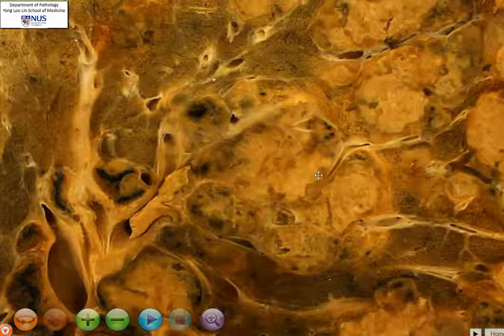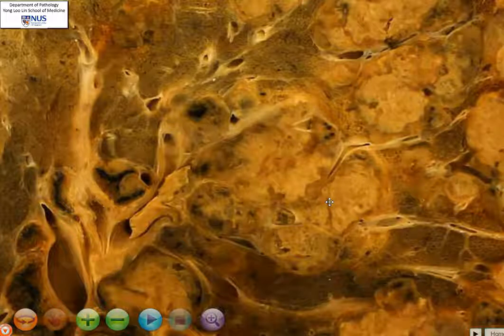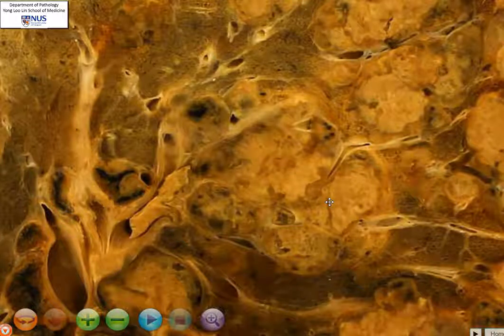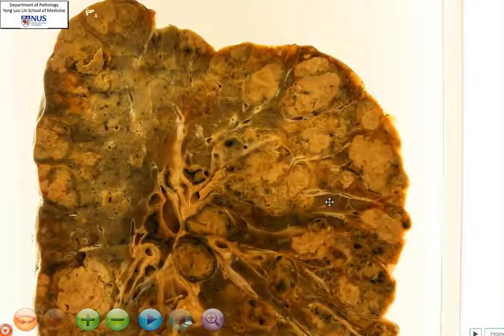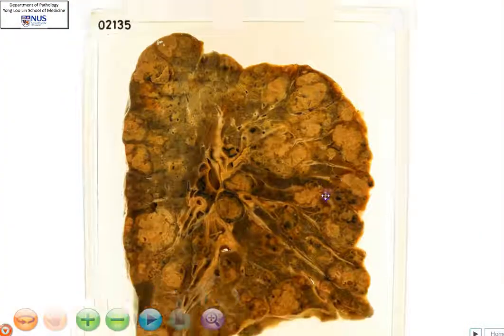These represent areas of necrosis. We learned that if a tumor is growing rapidly, it will usually outstrip its own blood supply, and this results in tumor necrosis. So this is an example of what an aggressive or rapidly growing tumor looks like.